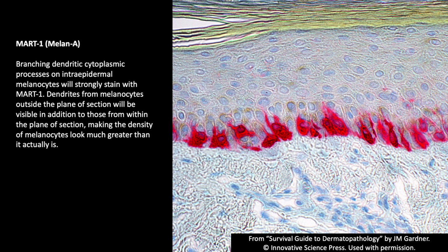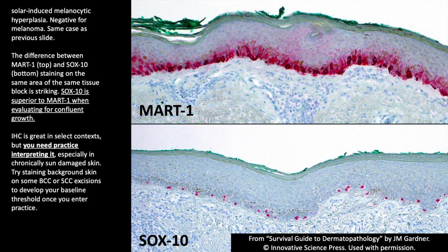I hope that makes sense three-dimensionally from home. Usually I use hand gestures to show, but I can't really do that now. So in any case, the point is you're going to see a lot more cytoplasm, whereas if you use a nuclear stain like SOX10 or MITF, it's just going to highlight those nuclei, and it's not going to lead to this very busy appearance.